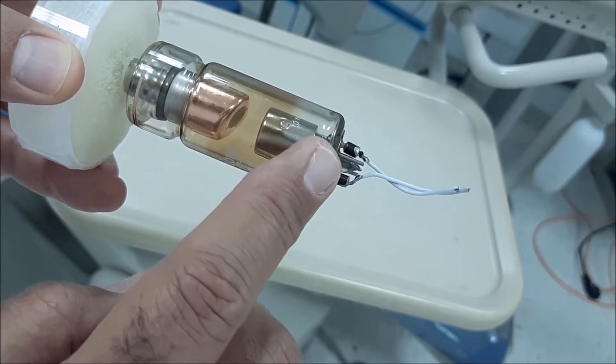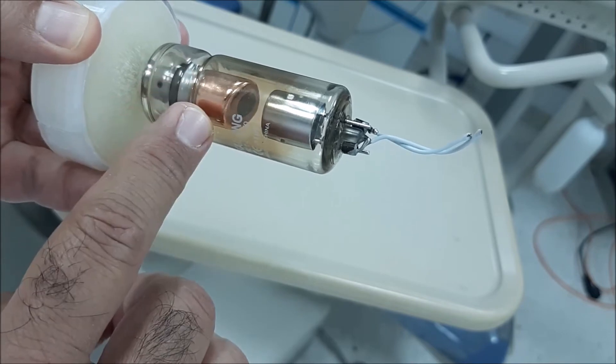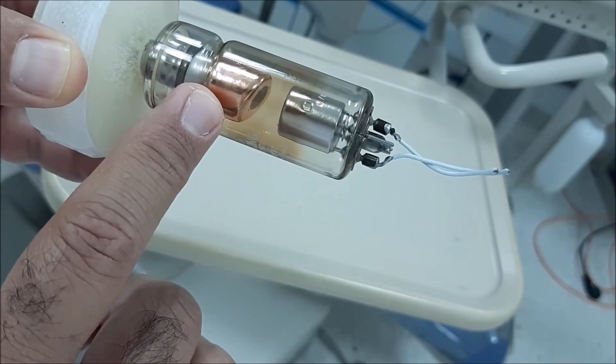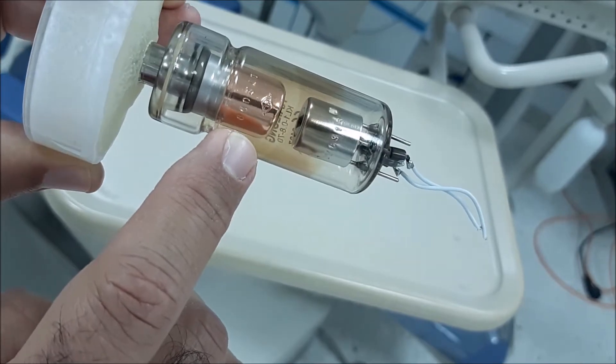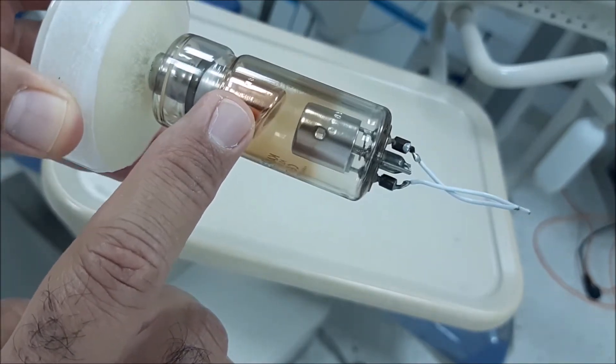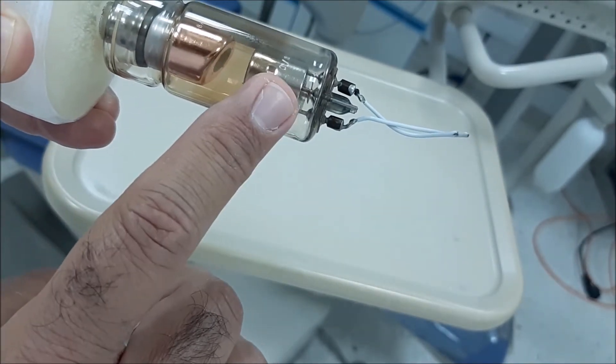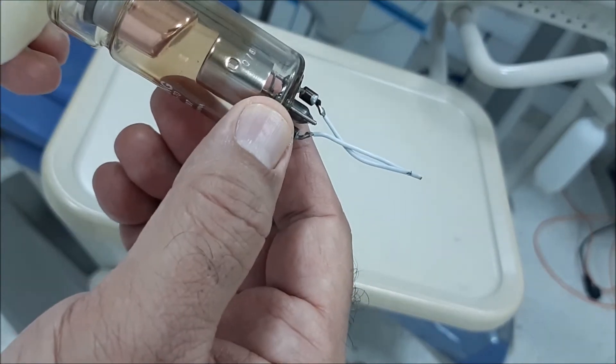So it is basically composed of the cathode and the anode. You can see from the difference in color - this is the typical appearance of copper. It is the anode, and this is the cathode. Now, let's start with the cathode.